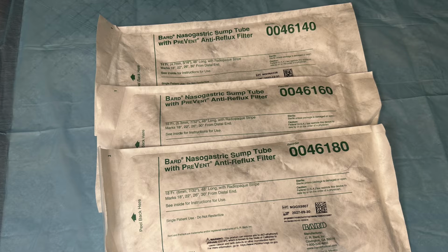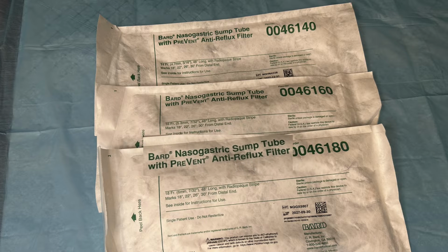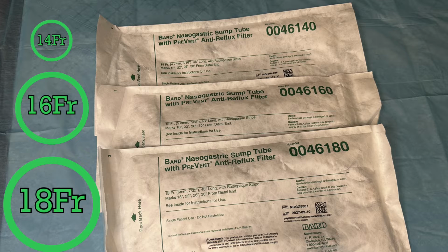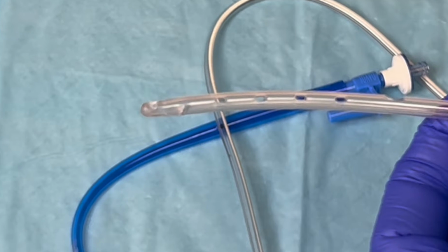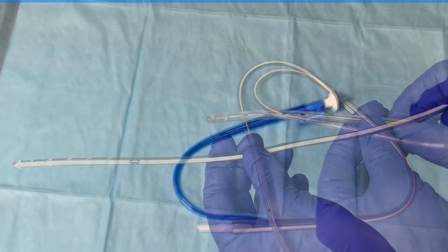At Trinity Health Livonia, the NG tubes available in the pod rooms are Salem sump tubes with Prevent anti-reflux filters. They are readily supplied in 14 French, 16 French, and 18 French sizes. With French sizing, the smaller the number, the smaller the tube, so a 14 French is the smallest of the three. The end of the NG tube that will sit in the stomach has multiple openings to allow flow into and out of the tube.